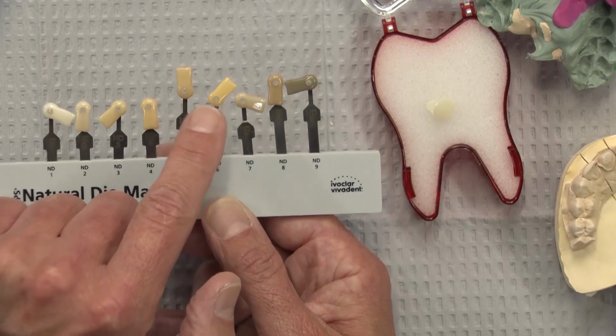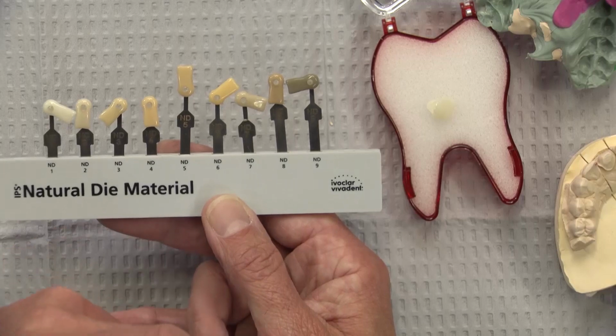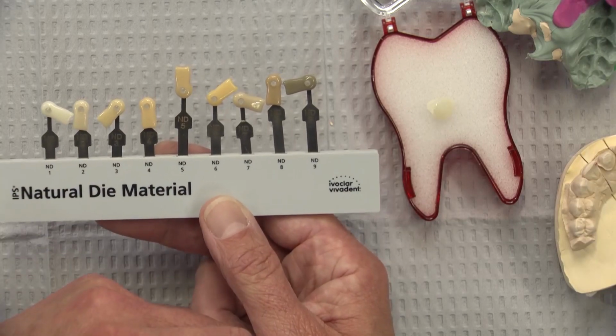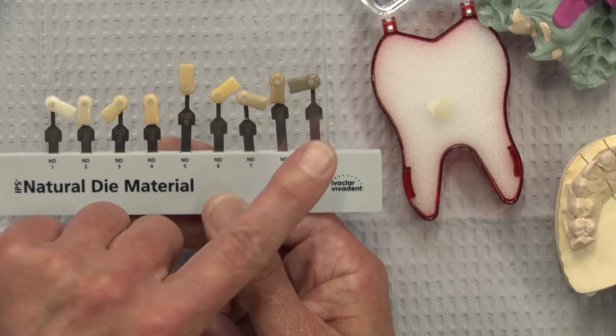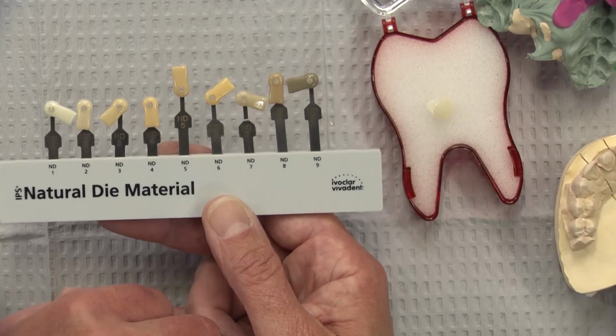So it's not just about what is the stump shade. It's about how big the spread is between the stump shade and the final desired shade of the restoration. You just can't make that huge leap to A1 from these shades. Not with e.max and not with anterior BruxZir.